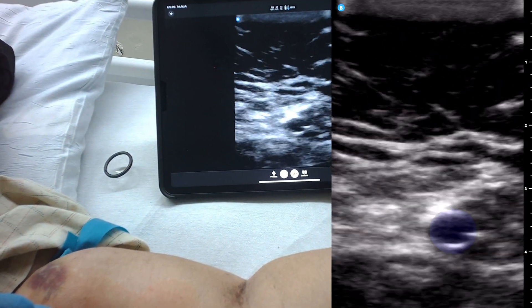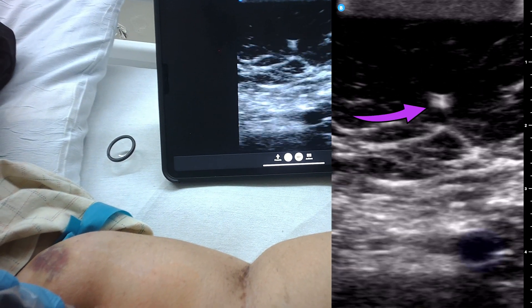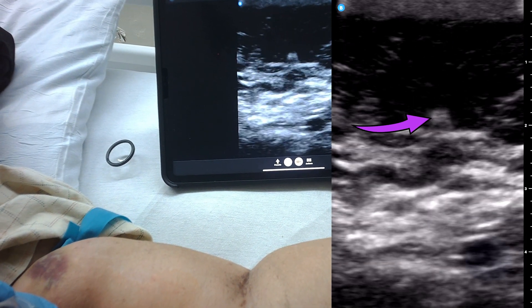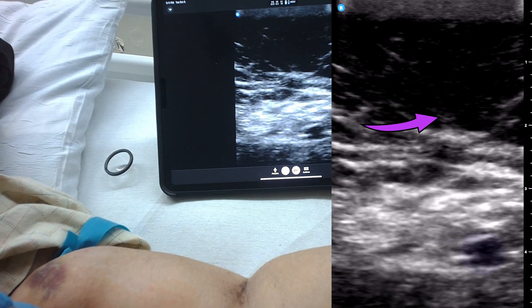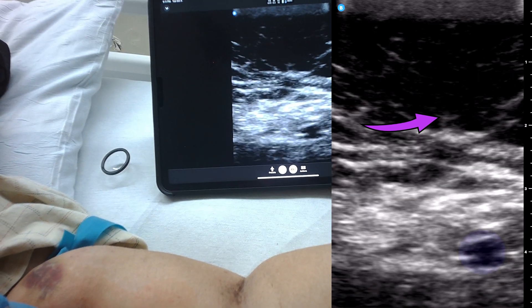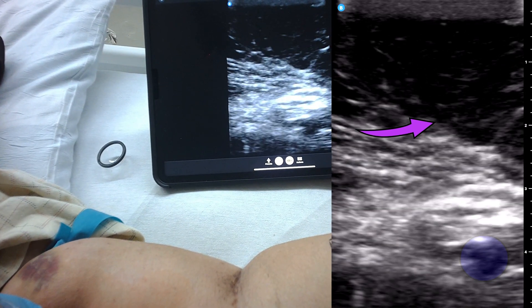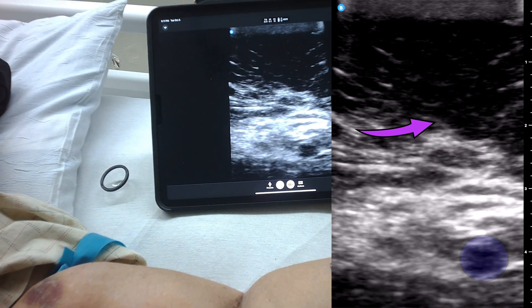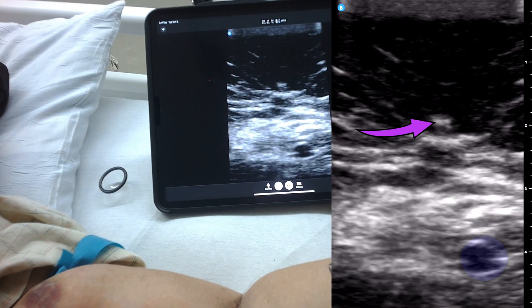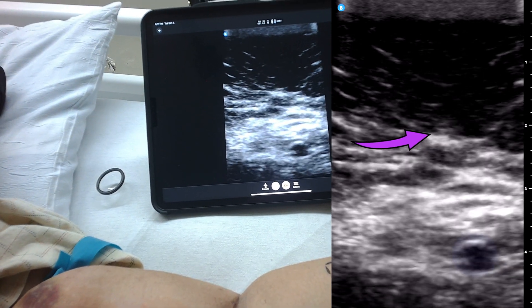Following the shadows — there we go. I believe that's the tip. There it is. I'm changing the image while bouncing it — just these micro-bounces. Try not to advance the needle, but move in and out to be able to see movement so I can get the tip. So that's the tip right there, moving it up and down, left and right.